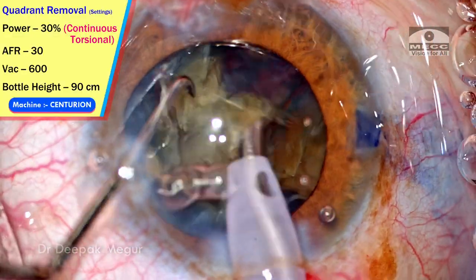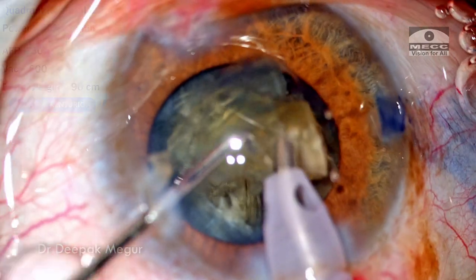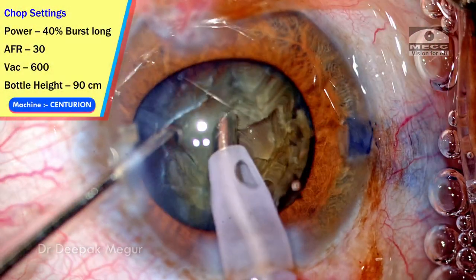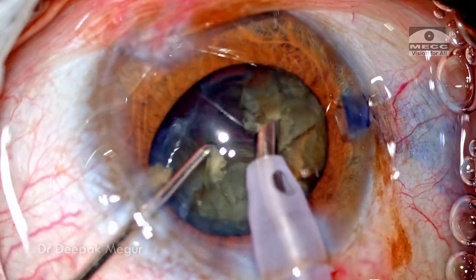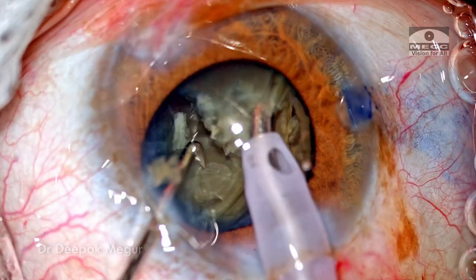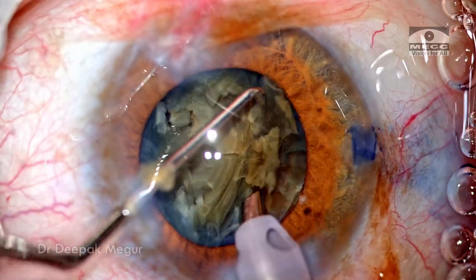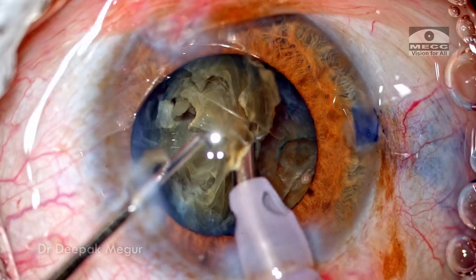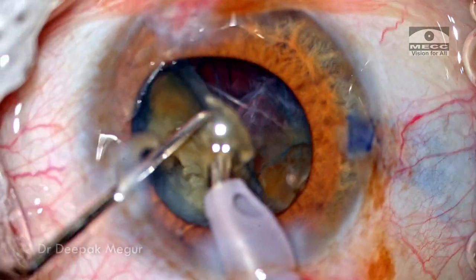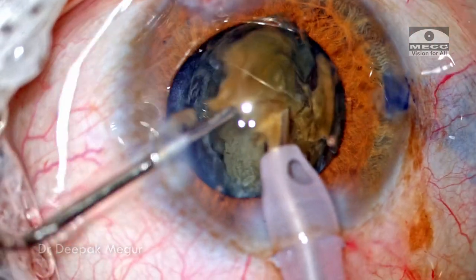The emulsification will be done using different settings — switching back to torsional mode because it has better cutting efficiency. Once the two fragments are taken care of, time to divide the heminucleus using chop mode. At this point the posterior plate is not cracking; it is holding the two adjacent pieces together. Because we have enough space in the capsular bag, I'm flipping the nucleus so that the posterior plate is turned anteriorly and I'm going to phaco the adhesion area itself — directly phacoing the posterior plate so that the adhesions holding these two fragments together are phacoed. So we have these two fragments free to be emulsified individually.